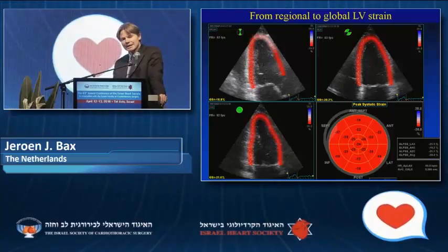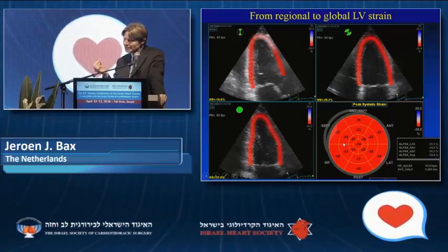And then we use again the same probe that we used before, which takes the 2-chamber, the 4-chamber, and the 3 or the 5-chamber in one shot. And with this one shot, we can then post-process this bullseye plot here, which is very similar to the nuclear one that we are used to. And you get then, in this polar plot, a global strain of the ventricle, which is actually the active deformation of this ventricle. And actually, if you look at normal individuals, the number for a normal strain is about 20.